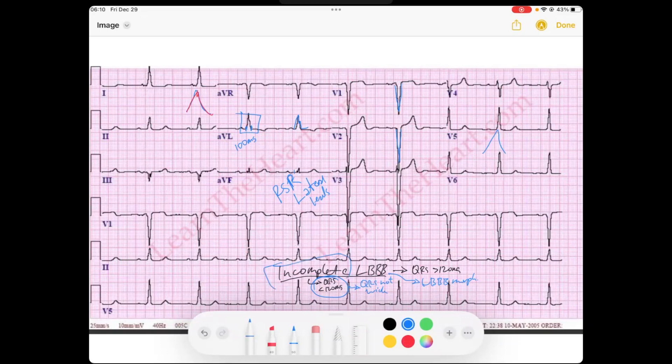The QRS is still less than 120 milliseconds. To an extent, we have also lost our septal R wave — the septal R wave represents depolarization of the septum, which is driven by the left bundle branch. Whenever you block it, even incompletely, you'll see changes in that little septal R wave. The septum depolarizes towards V1 and V2 from left to right. This is a good example of an incomplete left bundle branch block — hope this helps, just a quick little video.